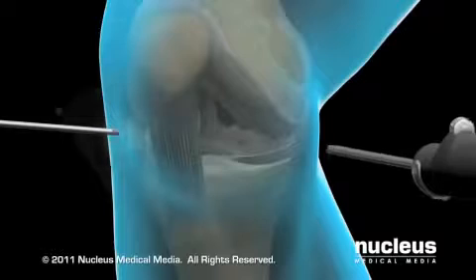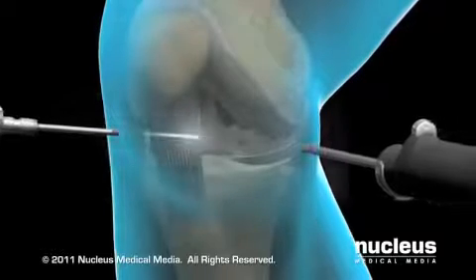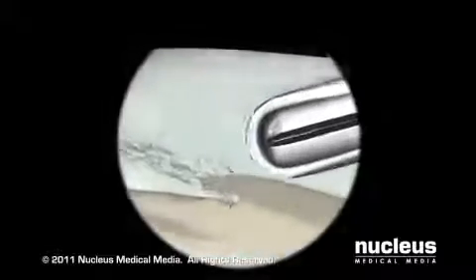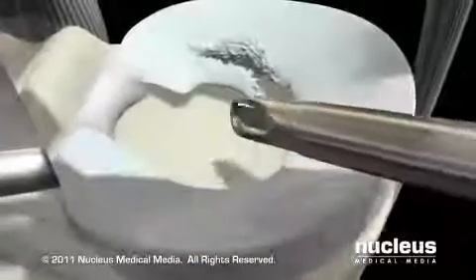Next, your surgeon will insert the arthroscope and other instruments through the various ports. Images from the arthroscope's camera are magnified and projected onto a video monitor.